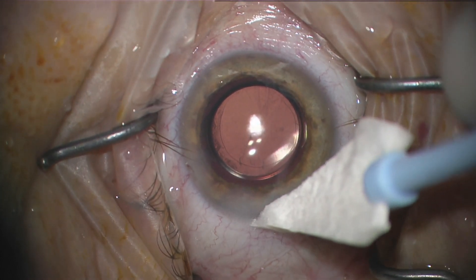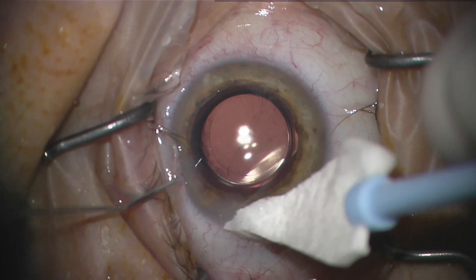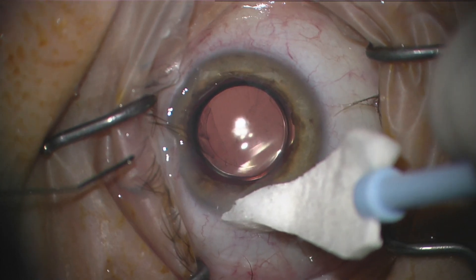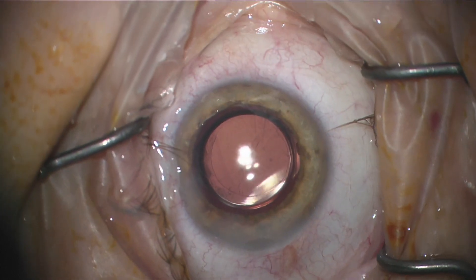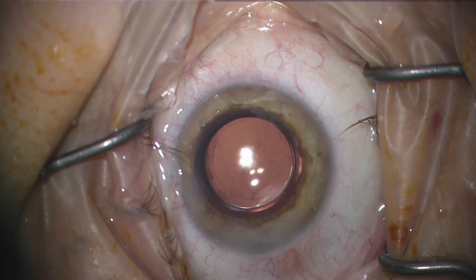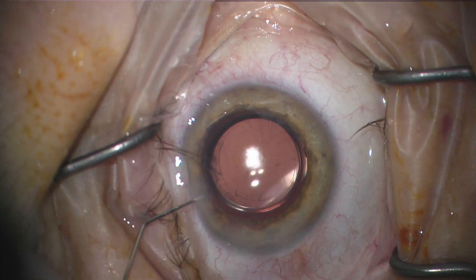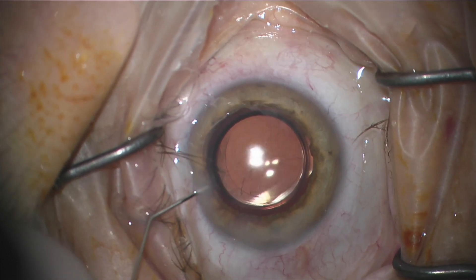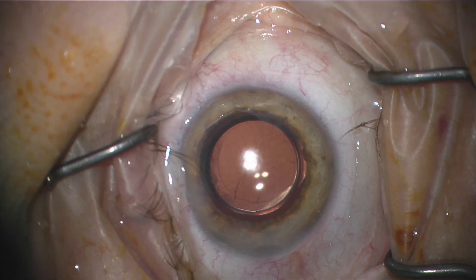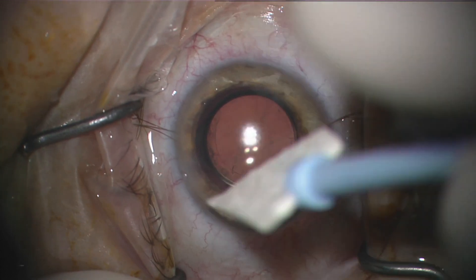Everything worked out just fine. Some extra touches because it's a larger incision than I normally do, and injecting moxifloxacin at the end of the case.